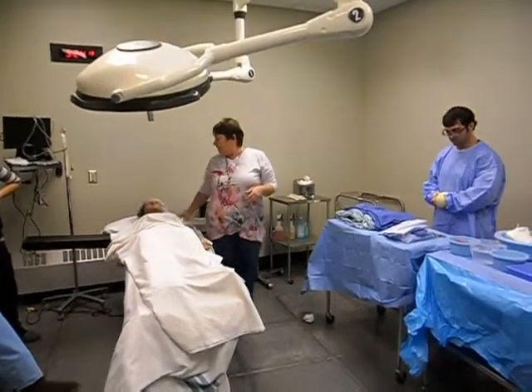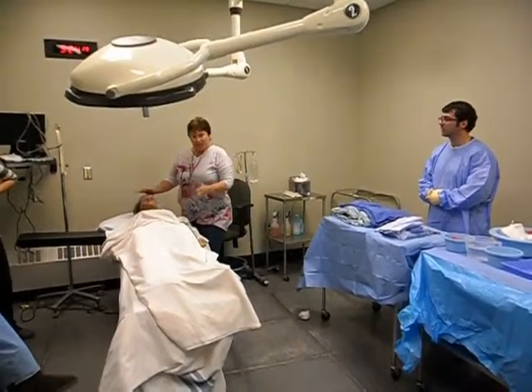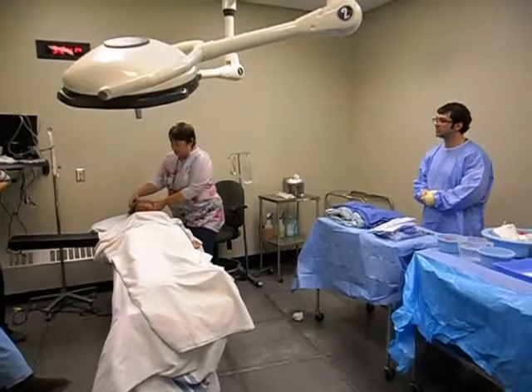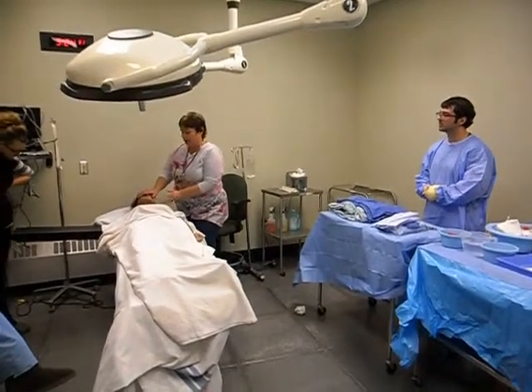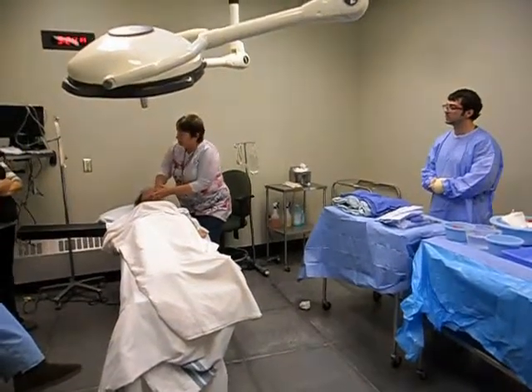And then, when we give these drugs, she's gonna go off to sleep. We're gonna say, Mrs. Hanson, can you hear me? Can you hear me? We'll close her eyes, put some tape over her eyelids so she doesn't have a corneal abrasion. Now I'm gonna put the endotracheal tube in with the laryngoscope.